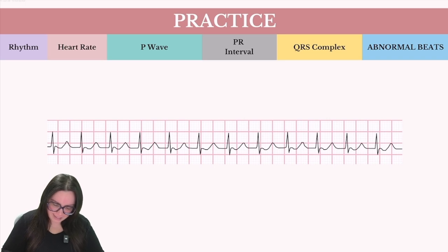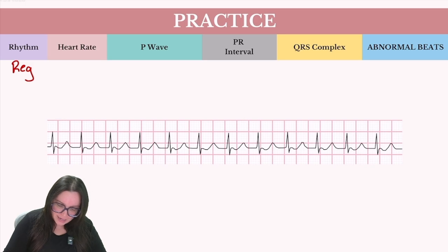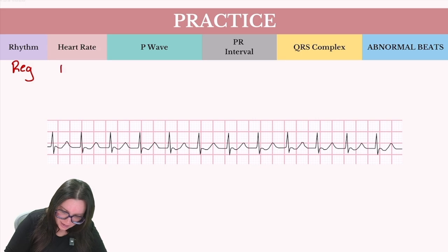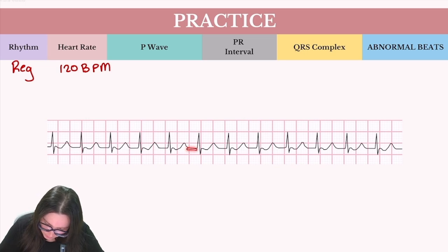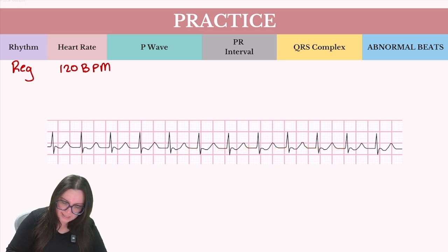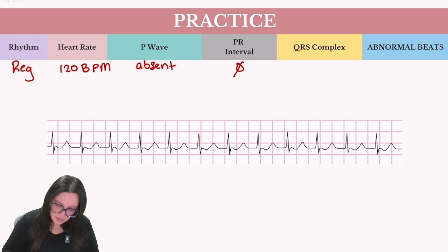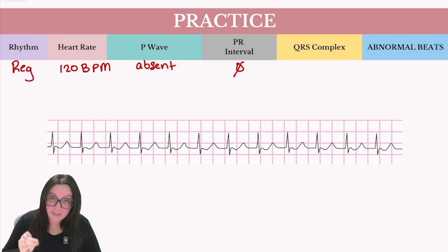Now we're going to take a closer look at our last example. Again, we start with rhythm — marching out between each R-to-R wave, I can see that I have a regular rhythm. Next, we want to determine our heart rate — counting the QRS complexes, I have approximately 12, giving us about 120 beats per minute. Taking a look at my P waves, I really don't have any P waves that I'm able to note here, so our P waves are absent. Because I don't have any P waves, there's no PR interval to be measured. Looking at our QRS complexes, they do appear to all be narrow and normal — these actually appear a little more narrow than before, approximately 0.04 seconds.